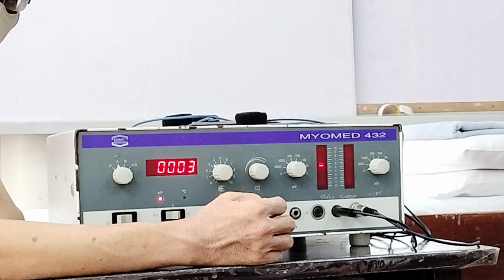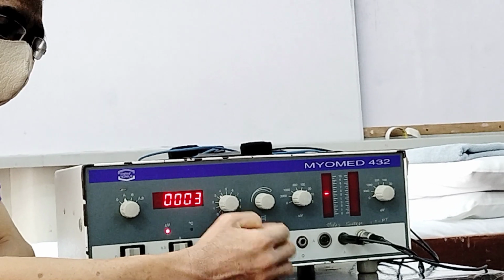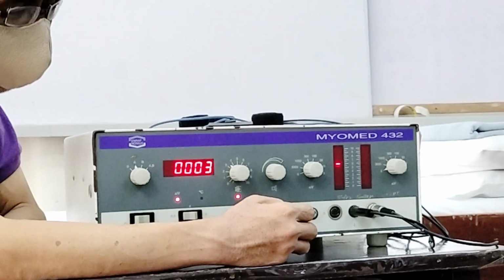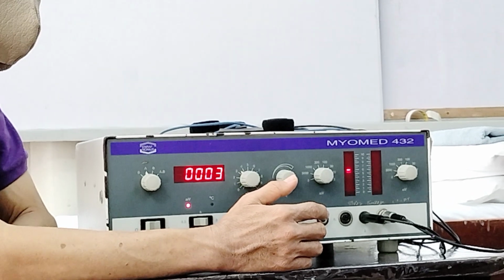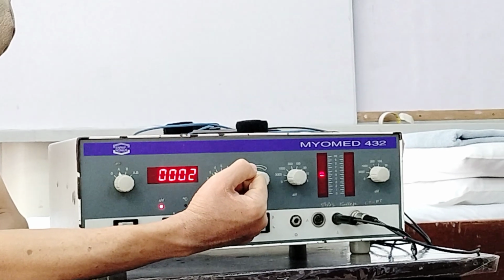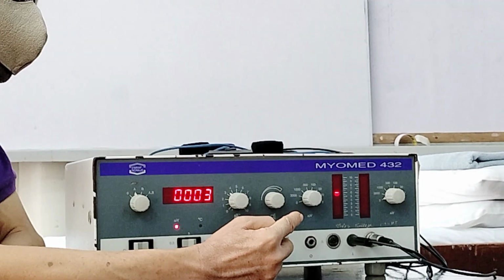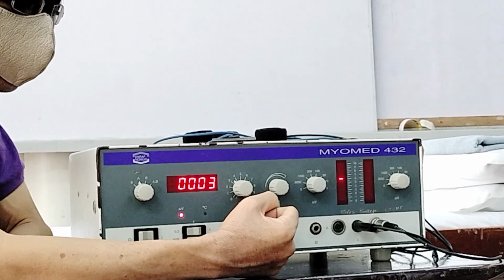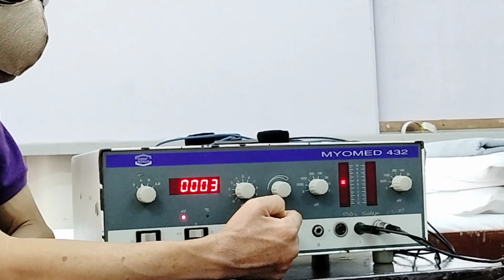Okay, kaya naman niya level 7. So the aim here is to further go beyond level 7. Again, it's part of the instruction. Sir, if you consider, I should tend to bend your wrist maximally, the bar reaches level 7. So what we're going to do here, sir, is I want you to further contract or bend your wrist, and try to further bring the bar further up to level 9.